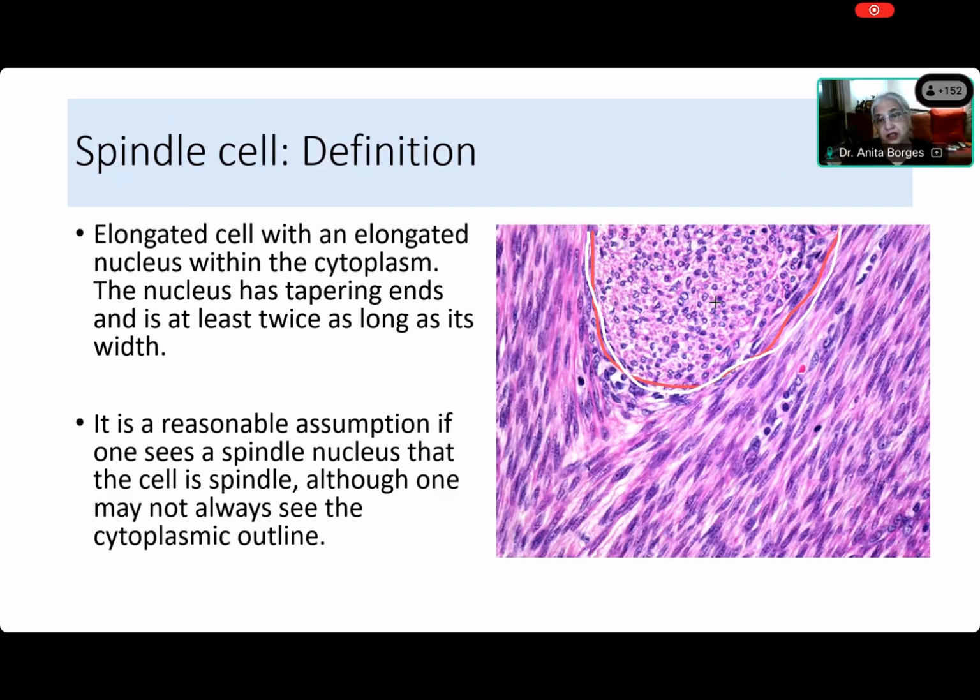spindle cells. They are spindle cells. Very nice. And how do we know that they are spindle cells? Because we should be thinking in 3 dimensions. When you cut a fascicle, you see all these cells running parallel to one another and parallel to the direction in which the fascicle is running. And when you cut a fascicle transversely, you can see.